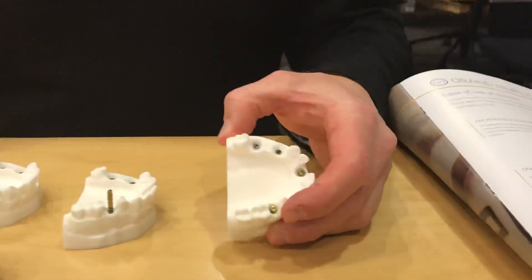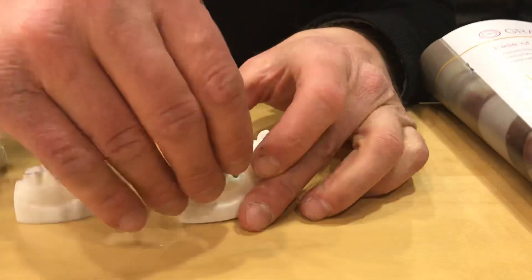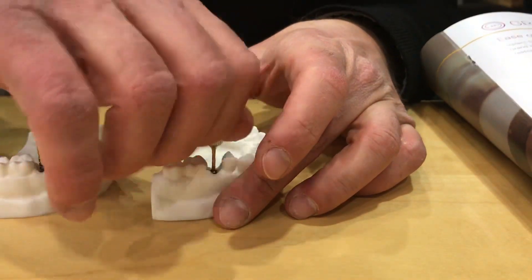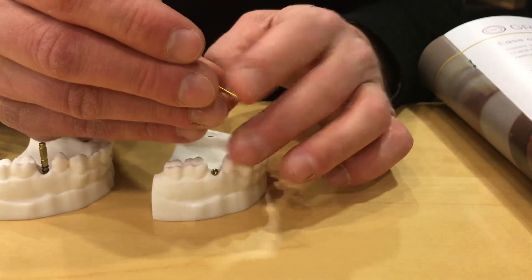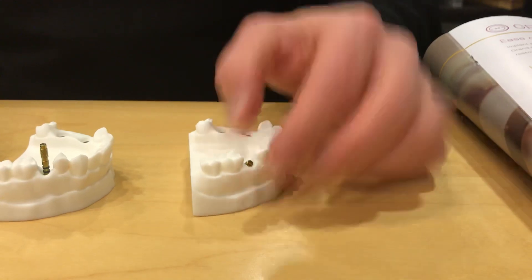We start with a single unit implant. We have our healing abutment in place, and we would simply remove that with our screwdriver. This happens to be what we call the Neo screwdriver — it's a star grip that grabs the top.